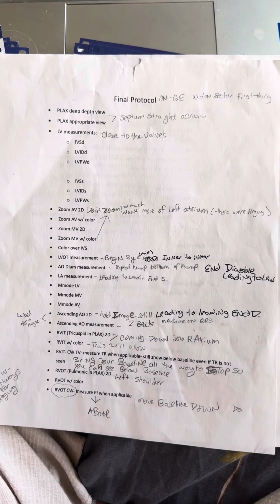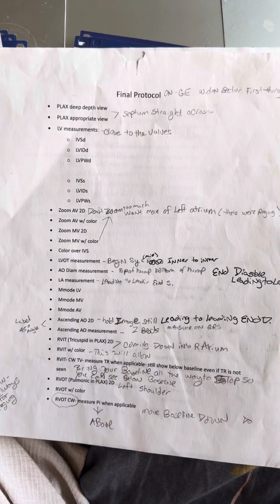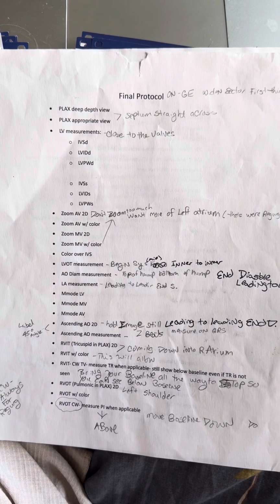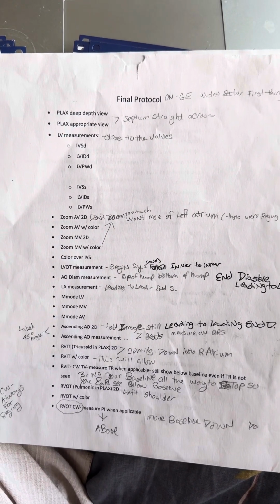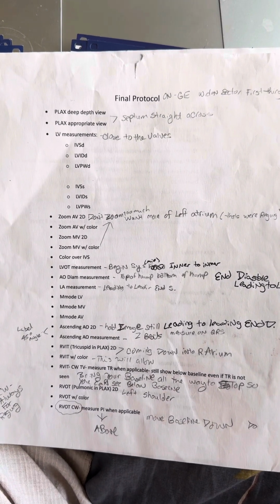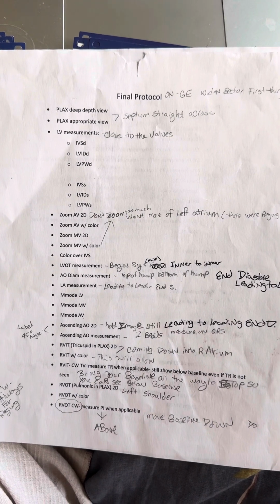Next, you will do ascending aorta and the measurement. You want to measure on end diastole, leading to leading.